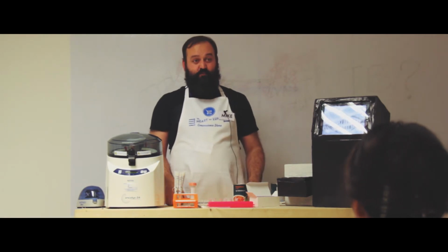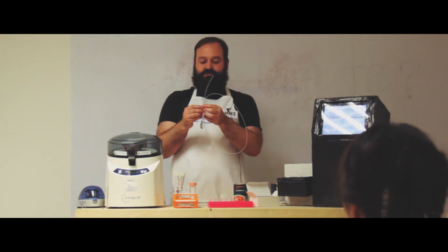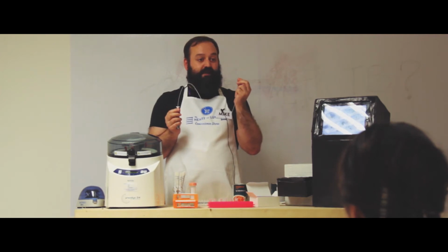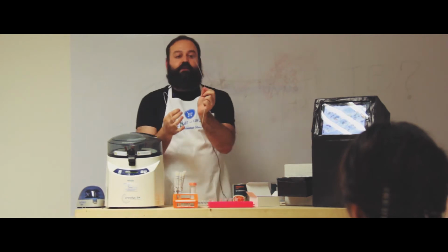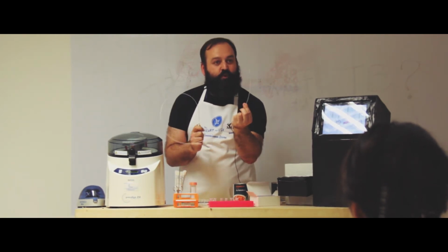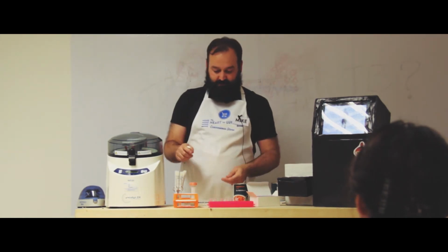The other way we can sample, which I'm not going to do to Phil, is the lung brush. So sometimes, if you're quite sick, a doctor will put this down into your lungs, so it gets fed down a tube into your lungs, and if you look at the end very carefully, there's a little bottle brush that they brush back and forth, and then they pull back out, and then we can use that sample to see what's going on down in your lungs as well.